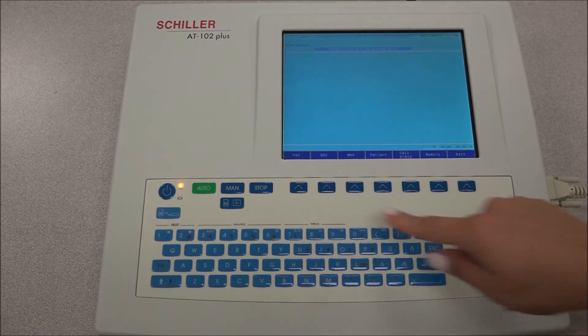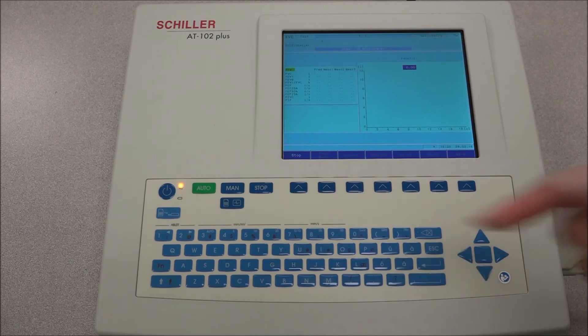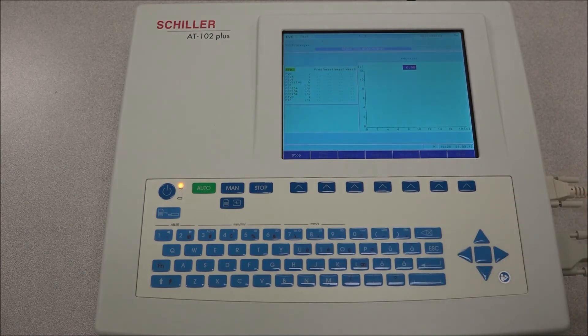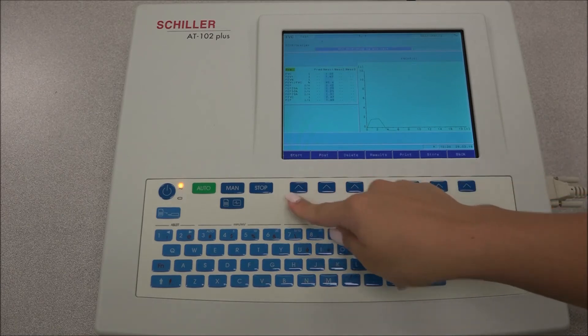The procedure for all tests is the same. Press the AUTO START key to begin the test. Once the test is completed, press the STOP key. It is recommended that a minimum of three measurements are taken.